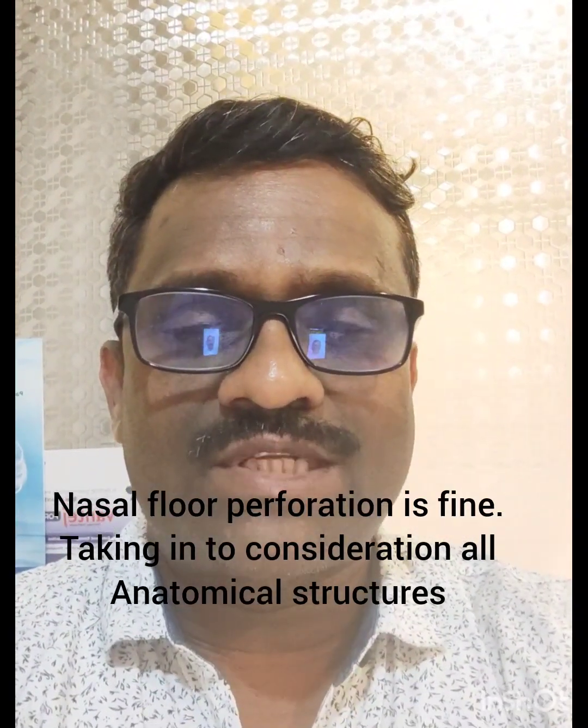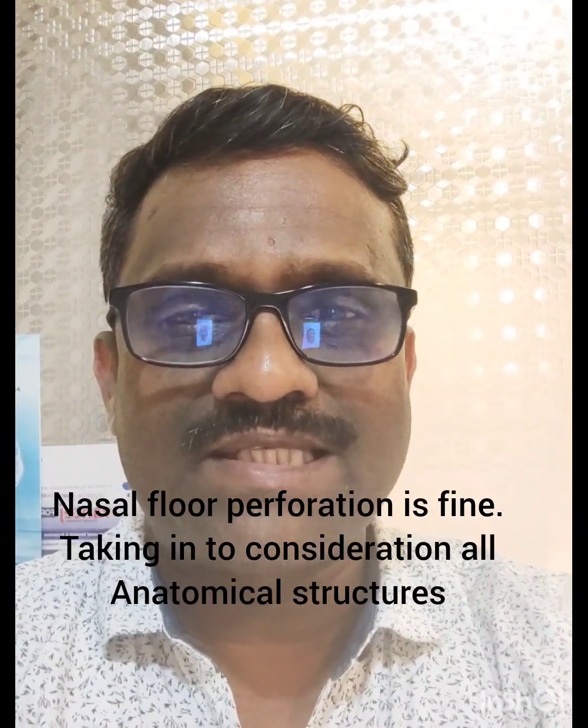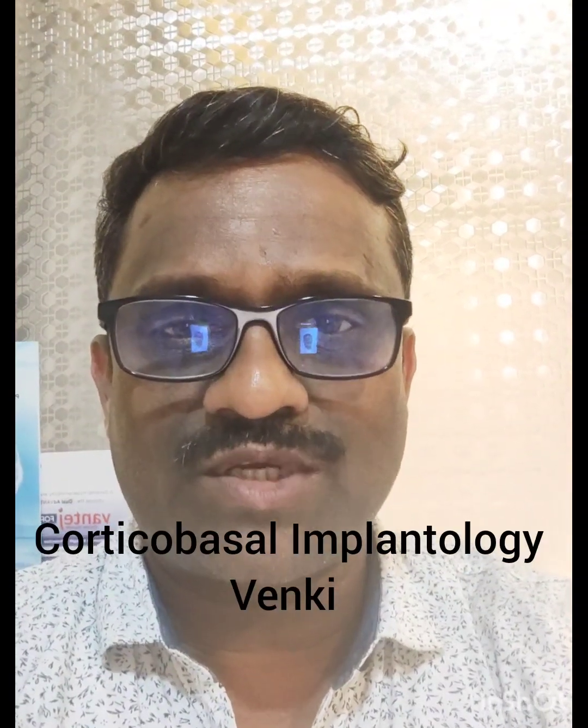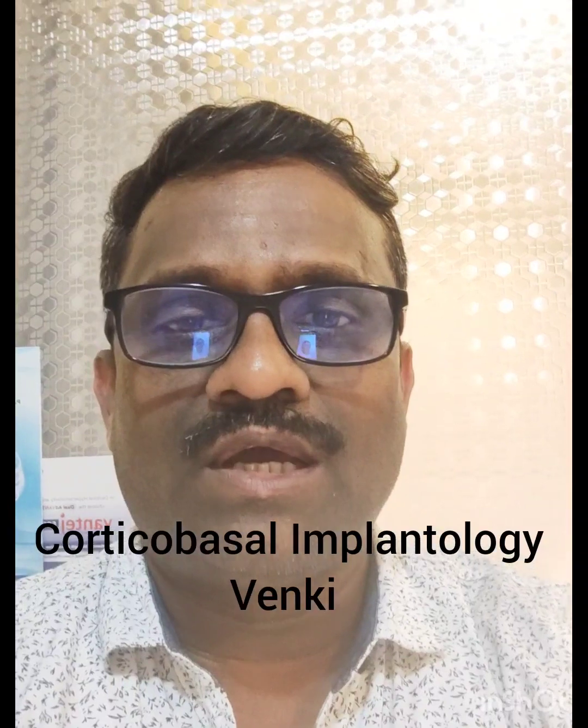Sometimes for some patients there may be epistaxis or nasal bleeding, but it's limited. Usually there will be droplets of blood because of the penetration into the nasal spine area. So this complication is manageable. This epistaxis is manageable with pressure with your finger or by placing a cotton swab inside the nostrils. It will stop for sure. So we have to perforate the nasal floor while placing the corticobasal implants.